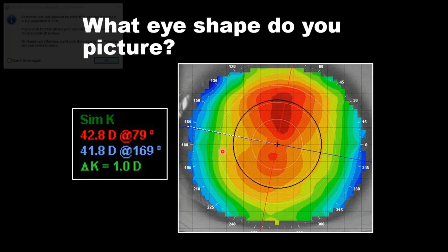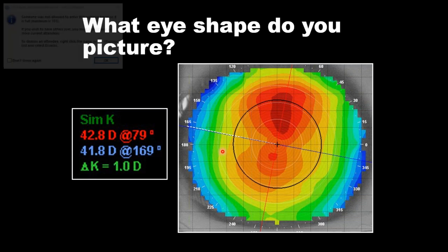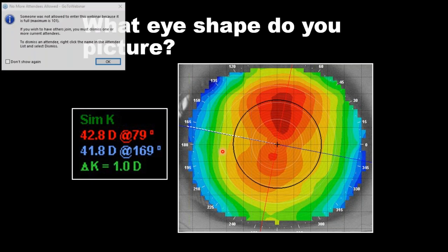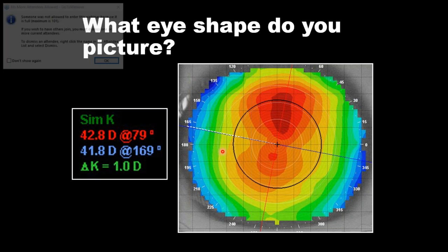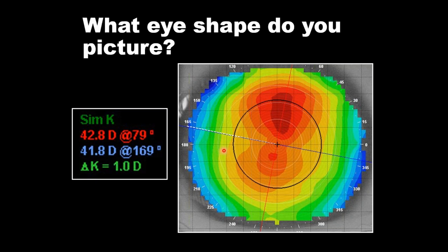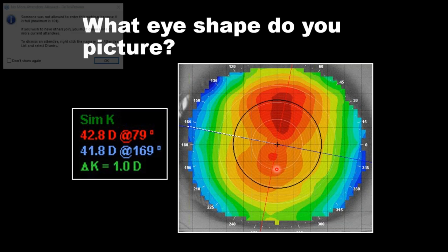This is the topography associated with these K readings — a simple, with-the-rule cornea with one diopter of corneal astigmatism. So K readings define this cornea very easily and very accurately.